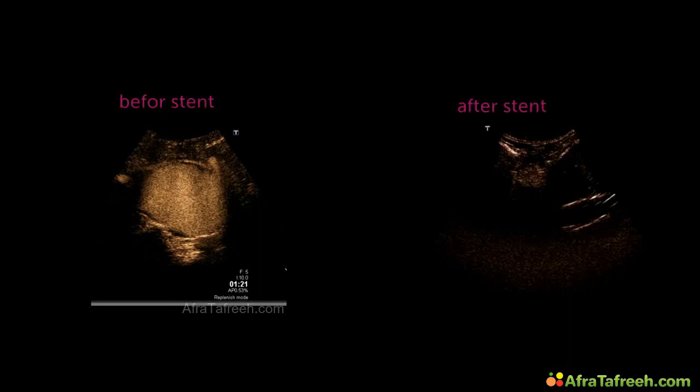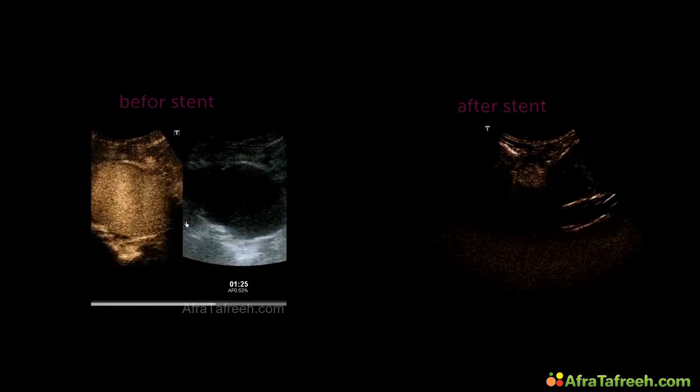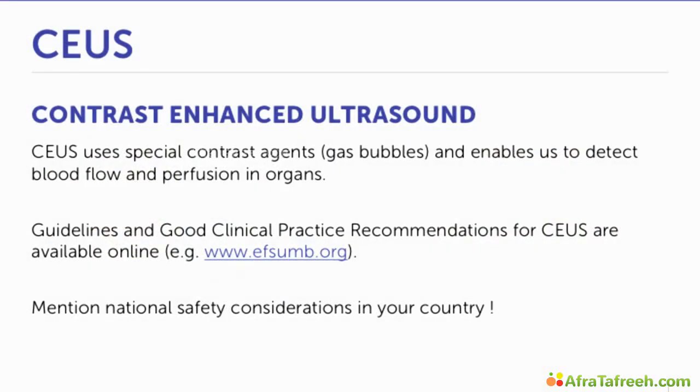A stent was placed in the abdominal aneurysm, and first we checked it with a contrast-enhanced ultrasound, and we saw contrast enhancing in the whole abdominal aneurysm. And after placing the stent, we repeated the examination, and there we can easily detect only blood flow in the stent, and this huge aneurysm has no vascularization anymore.